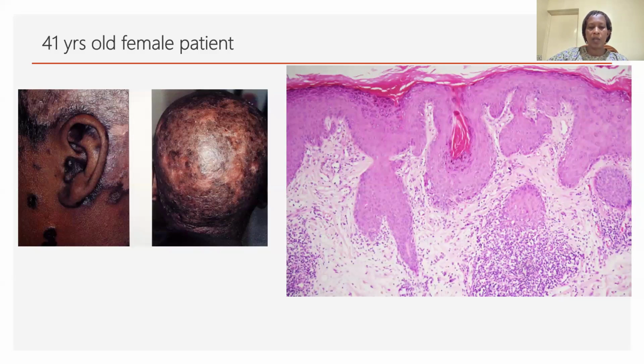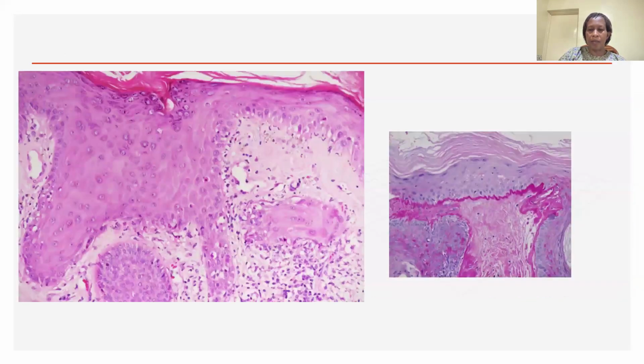Then we took some workup tests, including a punch biopsy. The biopsy revealed compact hyperkeratosis, some follicular plugging, and a superficial perivascular infiltrate, plus periadnexal infiltrate. On higher magnification, as we are going to see in the next slide, we see evidently that we have vacuolar degeneration at the basement membrane, but here also a perivascular infiltrate, as well as periadnexal.